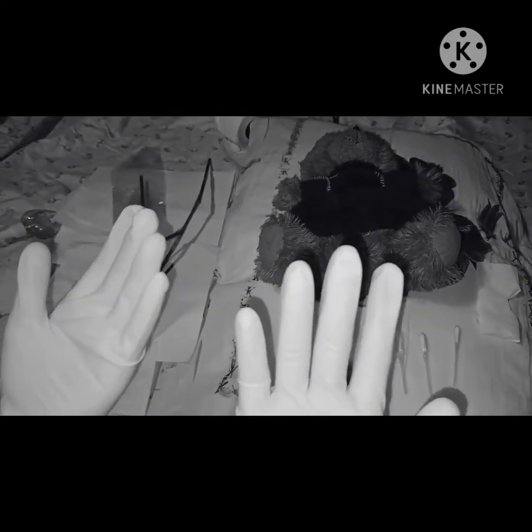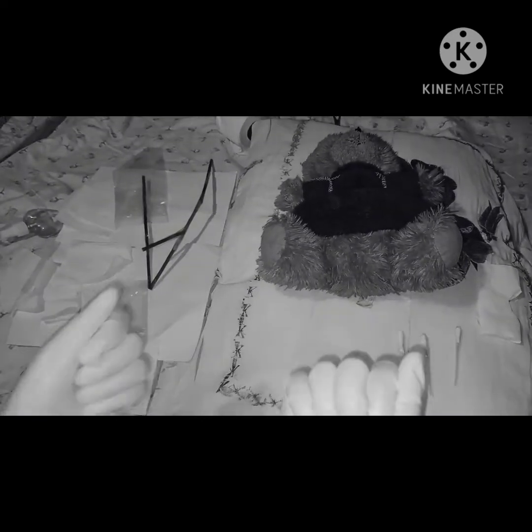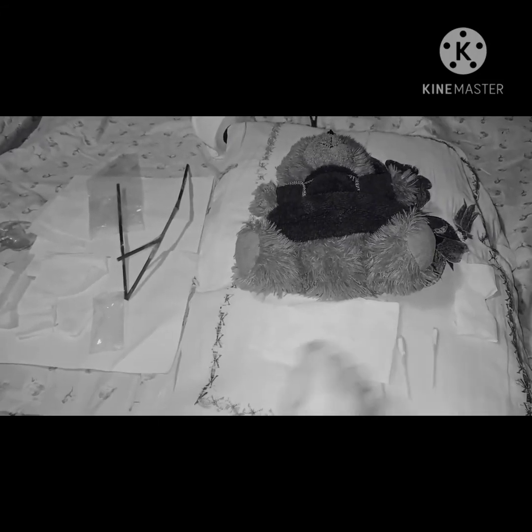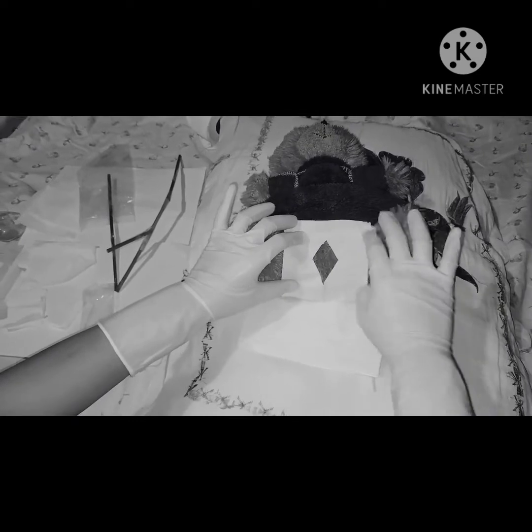Now I am done putting on the sterile gloves, and I must not put my hands below my waist. This will provide more privacy to my patient.